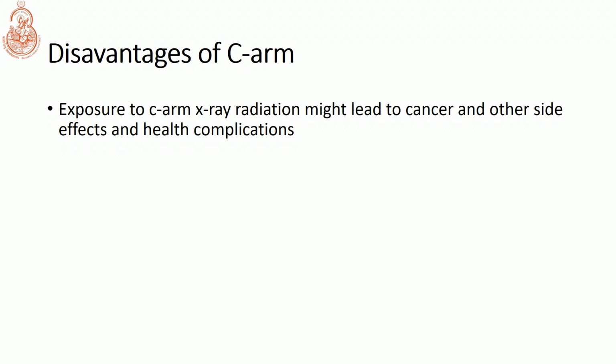Talking about the disadvantages of C-arm, the exposure to C-arm X-ray radiation might lead to cancer and other side effects and health complications.